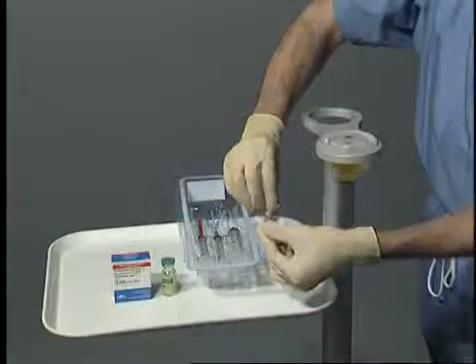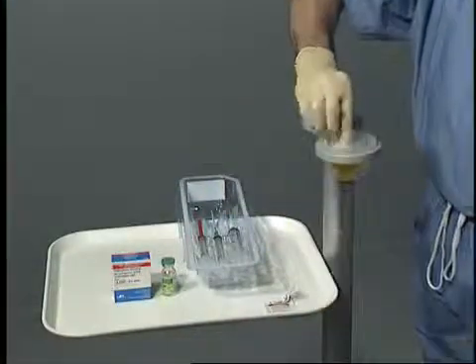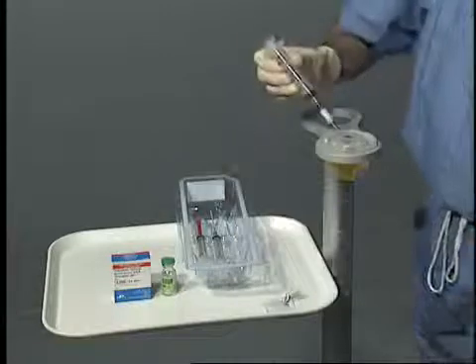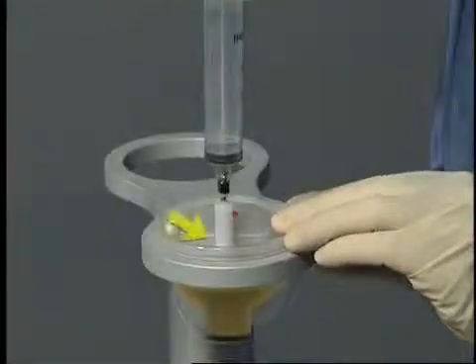Place the process disposable in the disposable holder located on the SmartPrep workstation. The plasma volume used for platelet resuspension when using the APC20 procedure pack is 3 milliliters. Using aseptic technique, insert the plasma syringe with a white spacer guide into the white port of the plasma chamber.